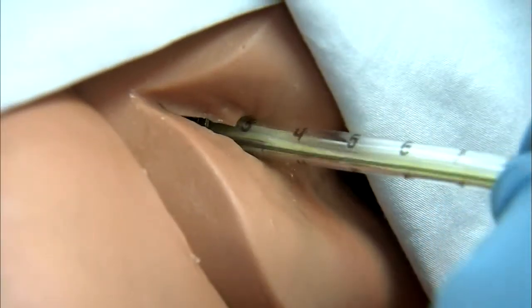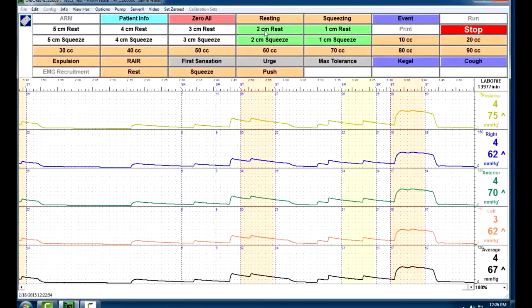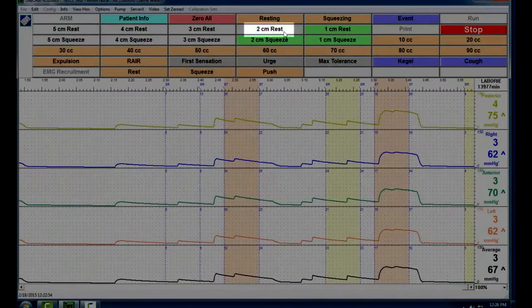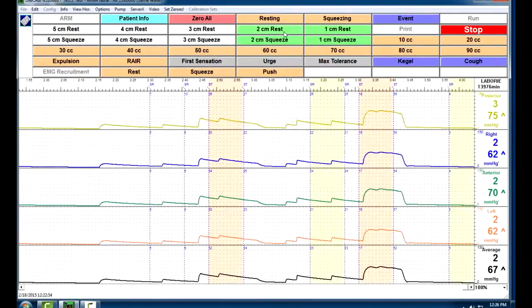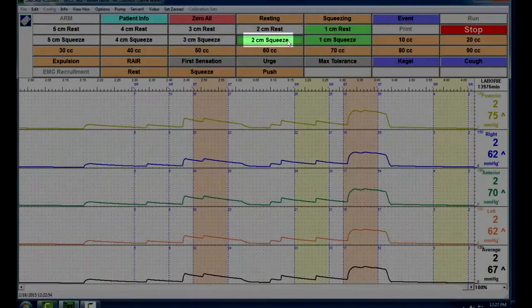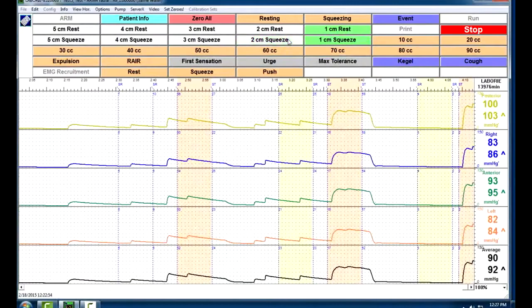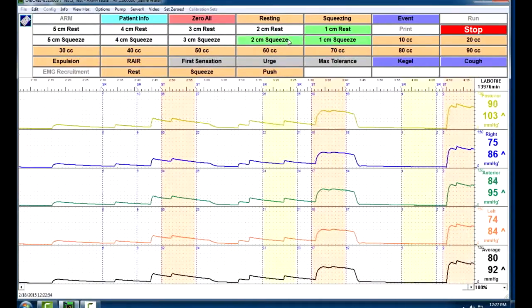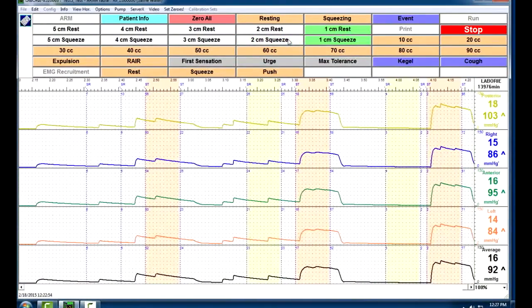We're going to pull the catheter out, same thing, out to the 2 centimeters. Once you're there and it's secure, go ahead and have them rest. Again, they don't even need to know you're doing it, but they're just resting there quietly. After the 10 seconds is up, we'll have them squeeze again. Okay, so instruct them, go ahead and squeeze, keep squeezing, that's it, don't let go, hold it, hold it, and after that 10 seconds, you can have them relax. Very good, and it comes back down to baseline.